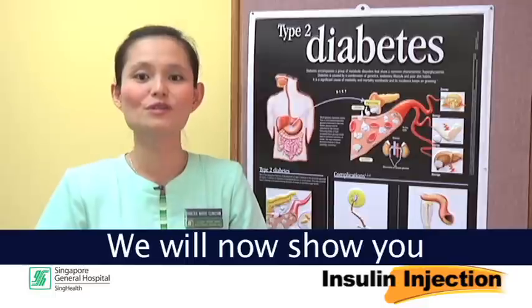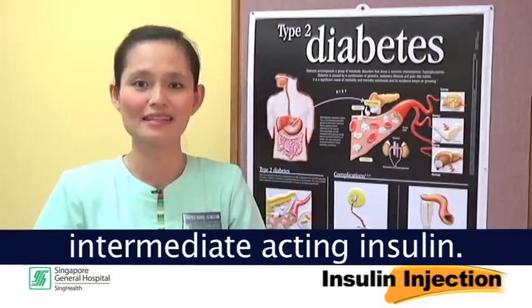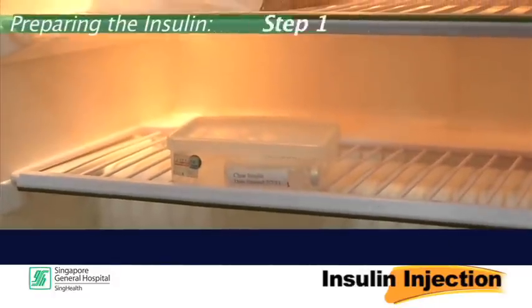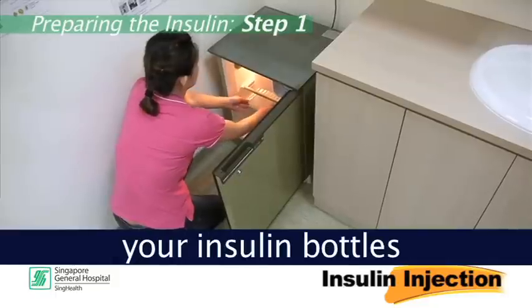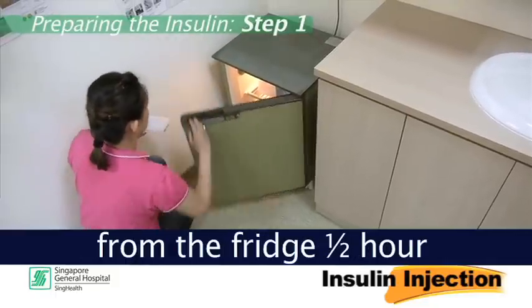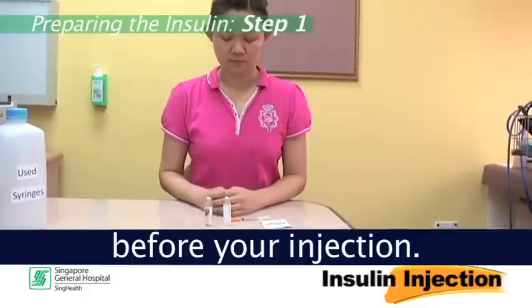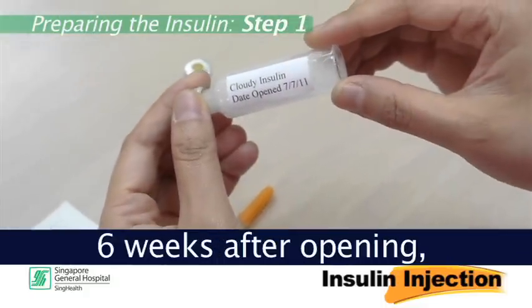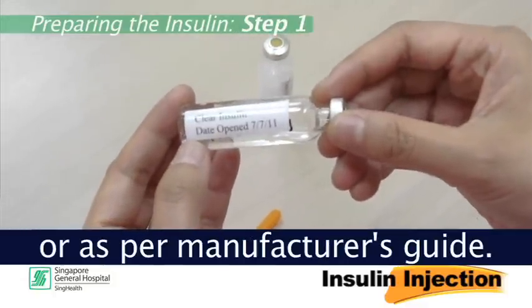We will now show you how to prepare the mixture of short and intermediate acting insulin. Step 1: First, prepare your supplies. Remember to remove your insulin bottles from the fridge half an hour before your injection. Check the expiry dates and discard the vials 6 weeks after opening, or as per manufacturer's guide.